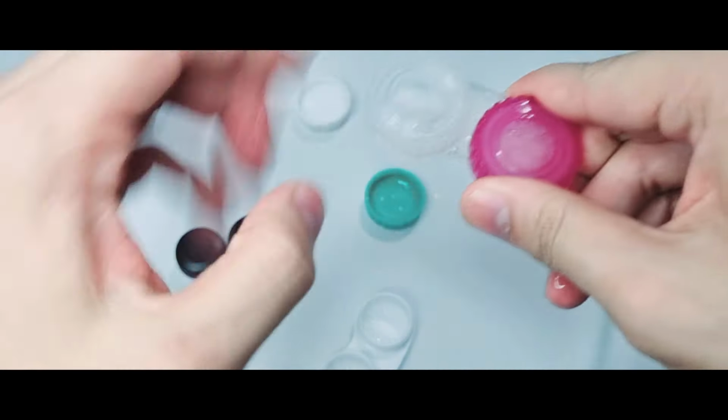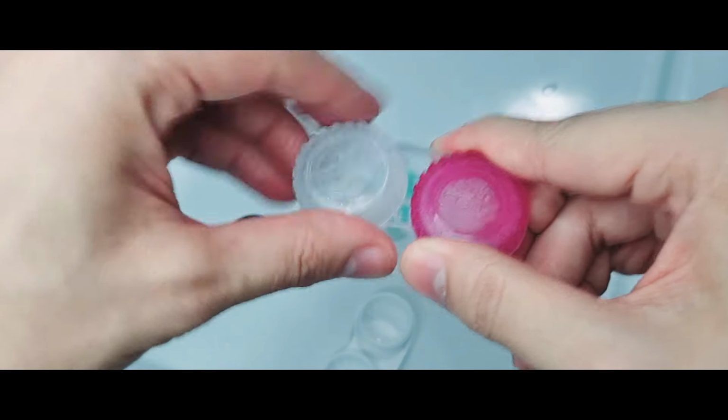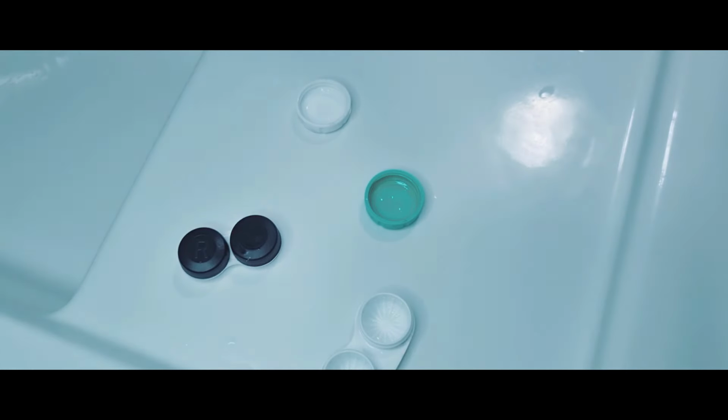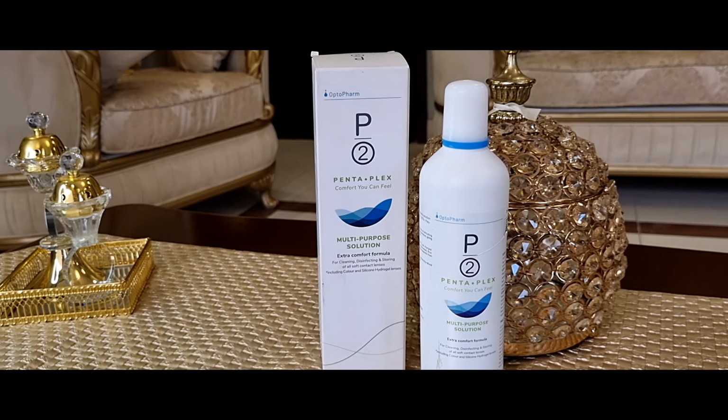That is really important. One bonus tip I would really like to share with you guys is don't overuse your contacts. If they are daily contacts, make sure to dispose them and open a new packet the next day. Or if they are weekly or monthly and you have to replace them every single month or every single week, make sure to do it on time.